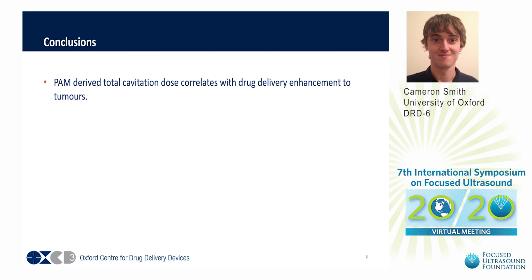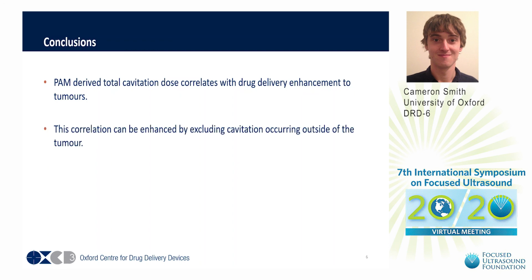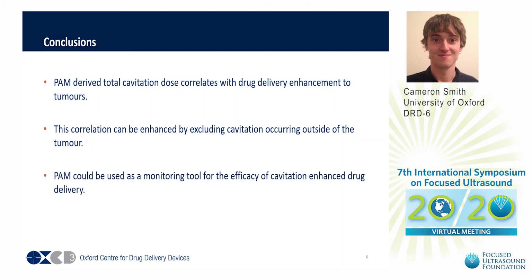So to conclude, PAM-derived total cavitation dose correlates with the drug delivery enhancement to tumors. This correlation can be enhanced further by excluding cavitation occurring outside of the tumor, and this shows that PAM can be used as a monitoring tool for the efficacy of cavitation-enhanced drug delivery.